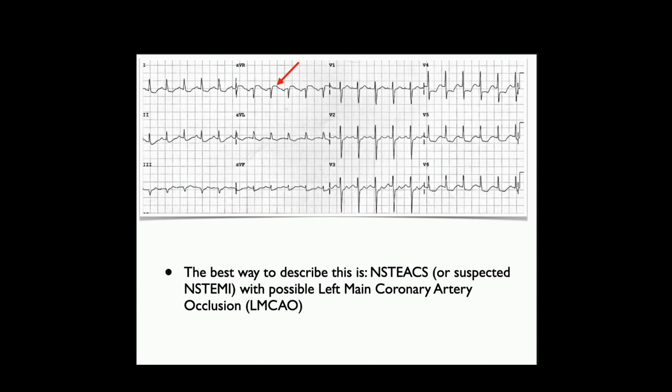Okay. Now, yes. The R wave in V1 seems to be a lot larger than normal. Is that indicative of anything? I'm not sure. I don't know if it is. It's a good observation. By itself, I don't know if it's something. So I think I'll just leave it at that, because if I look at it, the R wave progression, except for that, is not necessarily that bad. So I don't know if it means anything or not by itself.